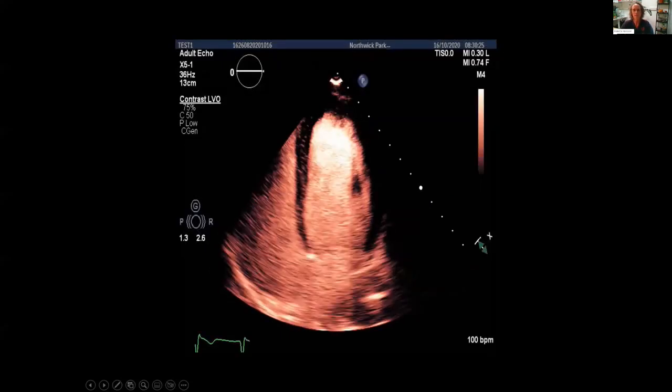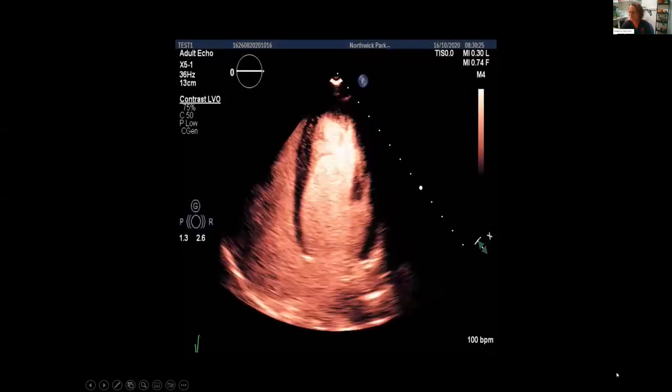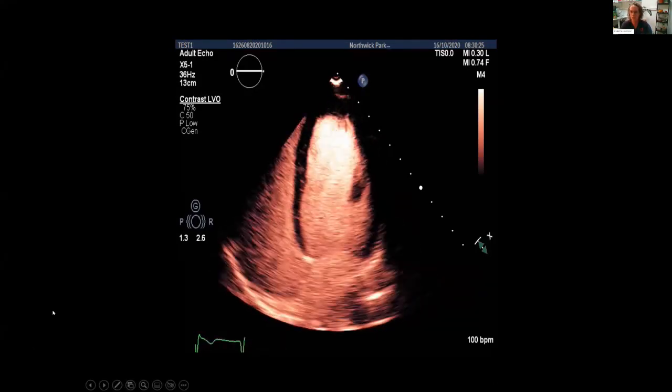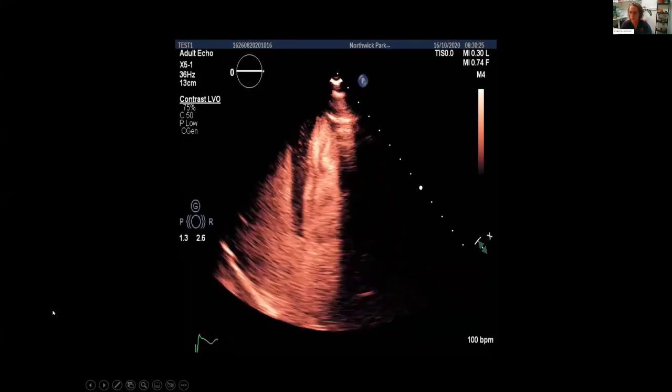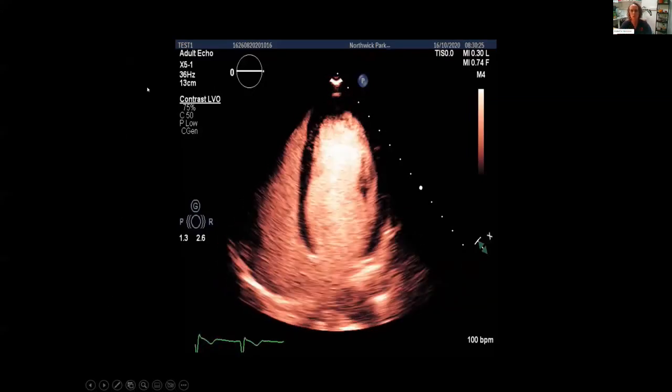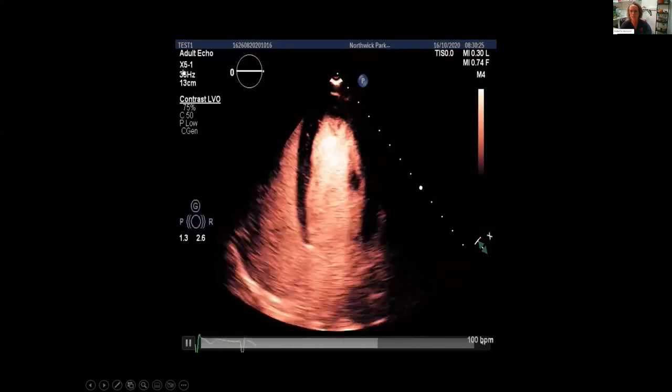So this is on the Philips machine, and we'll quickly look at the GE machine as well. This is your standard preset for contrast imaging on a new Philips system like the CVX. Preset, you basically choose your transducer. In this case, this is a 3D probe.